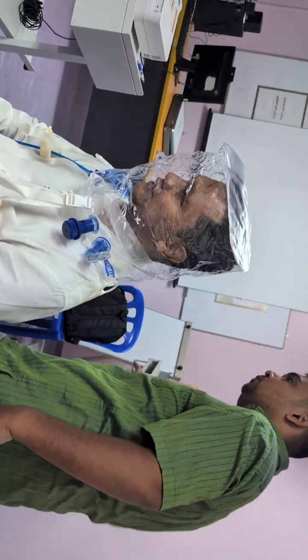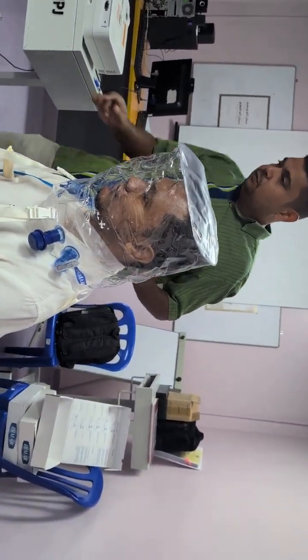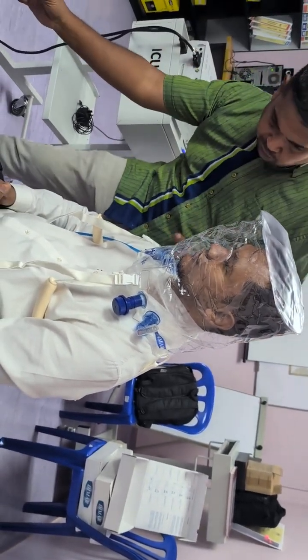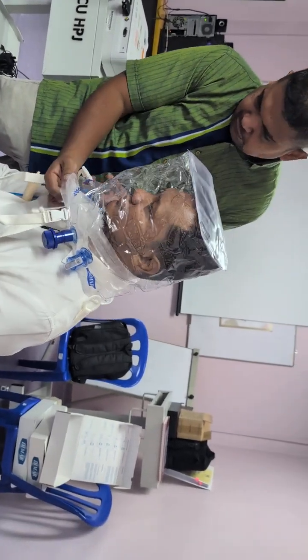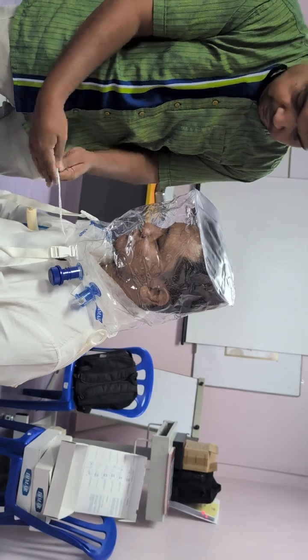You see, now there is a lot of leak which is happening. Okay? So, there's no 7, so I'm just going to go up a bit. You see the leak here, so big, eh? So they have already given you this.